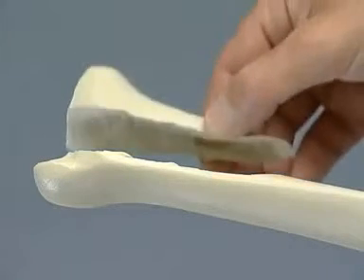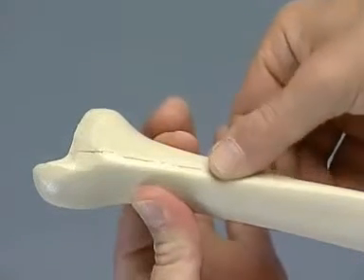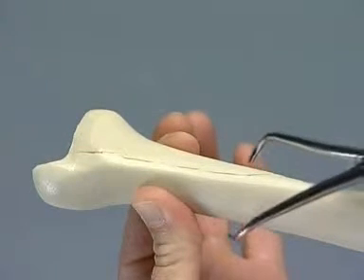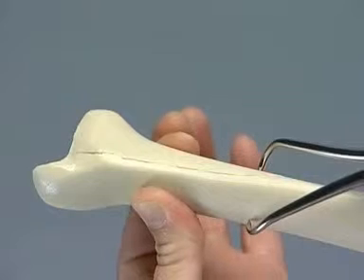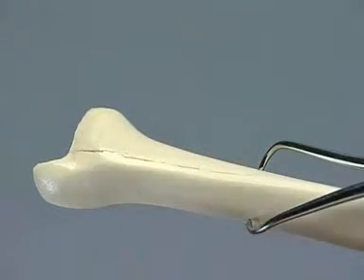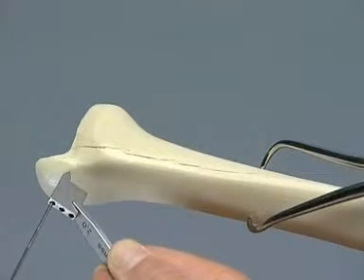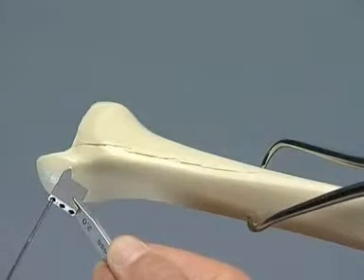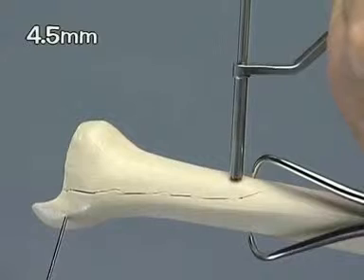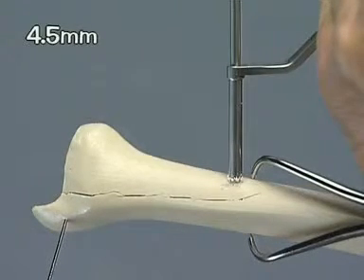The fragment is reduced and fixed proximally with a pointed reduction forceps. For temporary fixation to ensure joint alignment, insert a K-wire distally parallel to the joint. In the proximal region of the fragment, drill a gliding hole for a cortex lag screw with the 4.5 millimeter drill bit.